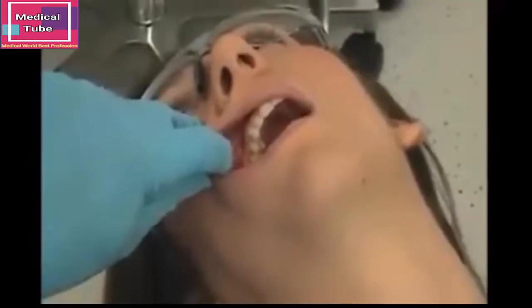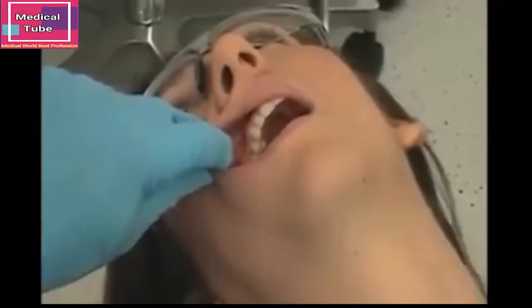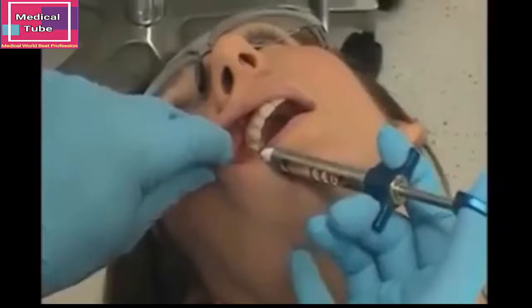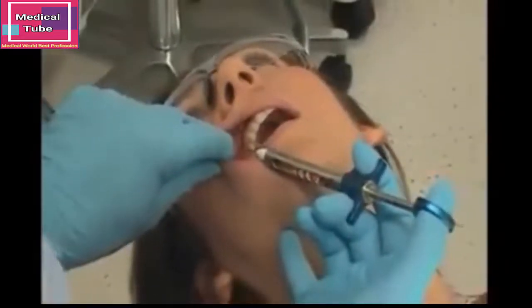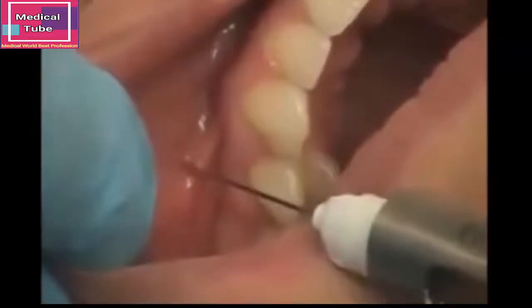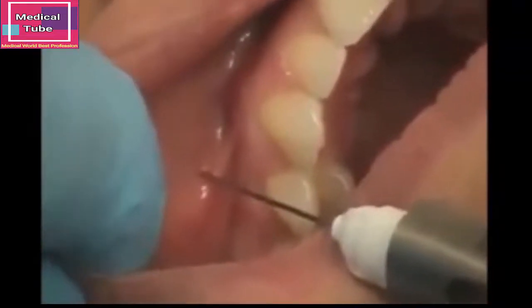The syringe position is to orient the syringe towards the infraorbital foramen. The needle should be held parallel to the long axis of the tooth at the height of the mucobuccal fold directly over the first premolar. The bevel orientation faces towards the bone.